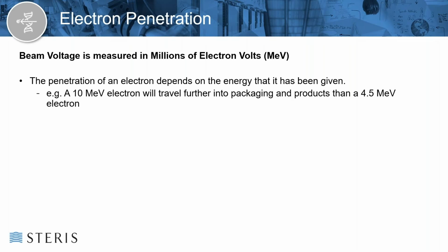So if you go much over 10 MeV, you might find a small amount of induced radioactivity in some metals. It's really quite minor, but the normative standards have you assess for radioactivity if you're operating your electron beam anything over 10 million electron volts, which is why you'll see 10 million electron volts as the common energy of beams that we're trying to use for these sort of purposes.